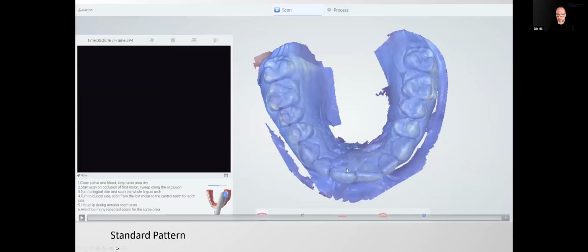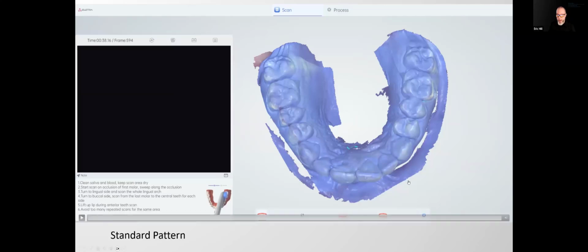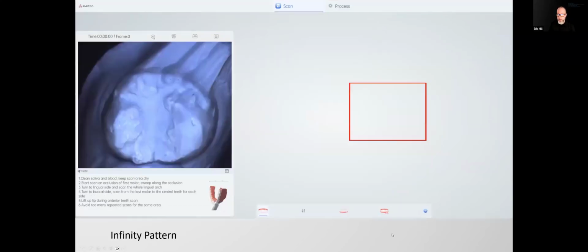If something like that is on the opposite side of the mouth, of course, that is not pertinent, so you can just let the AI fill that in. But simply go in and fill in the margin area, as well as the contacts, and you should be in good shape there. Usually in most other scenarios, the little AI patches are going to be perfectly fine.